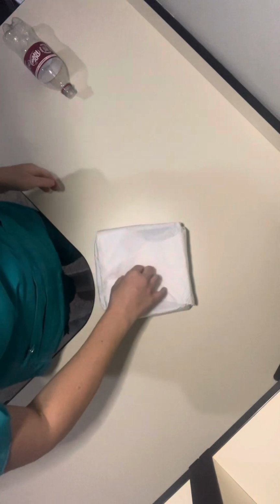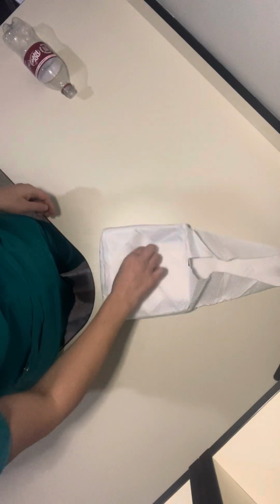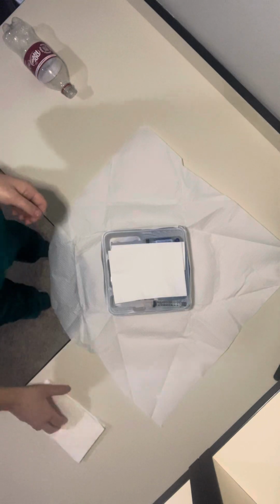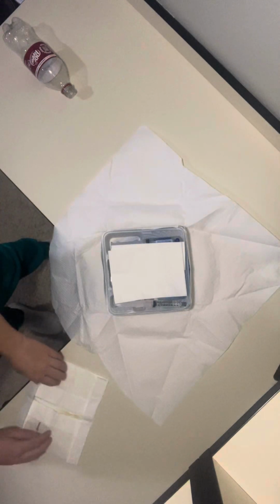Okay, so I'm just going to open my sterile field right now. So I'm going to start with it away from me. Okay. And then I get my gloves. Now my gloves do have a tear in them from when I put them on. They broke when I put them on, but I'm still going to go through the motions.